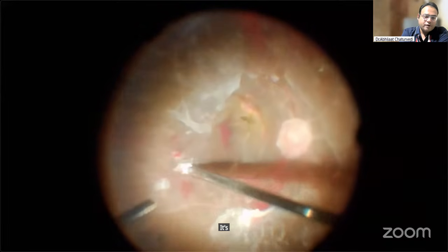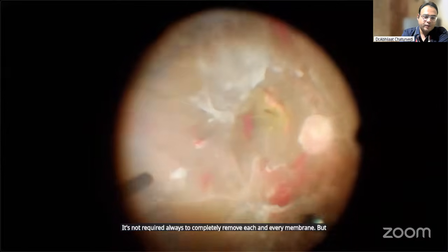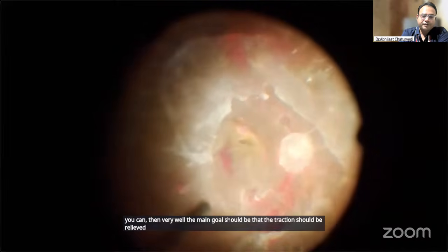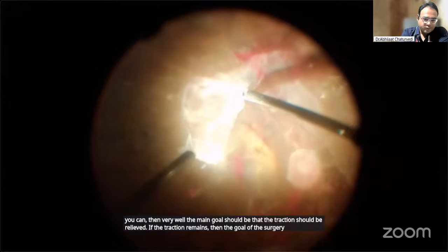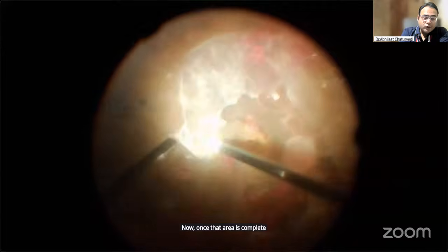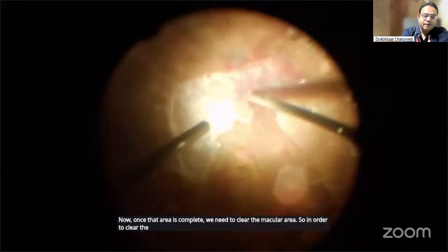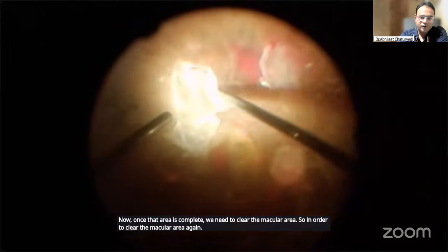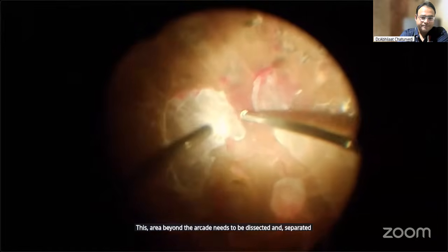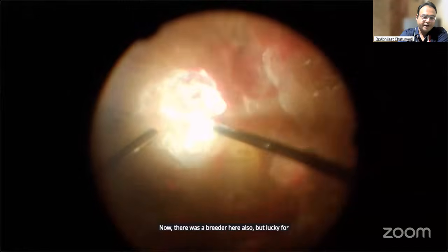It's not required always to completely remove each and every membrane, but if you can, then very well. The main goal should be that the traction should be relieved. If the traction remains, then the goal of the surgery would become null and void. Now, once that area is complete, we need to clear the macular area. So in order to clear the macular area, again, the area beyond the arcade needs to be dissected and separated first. Now, there was a bleeder here also, but lucky for us, it didn't bleed a lot.